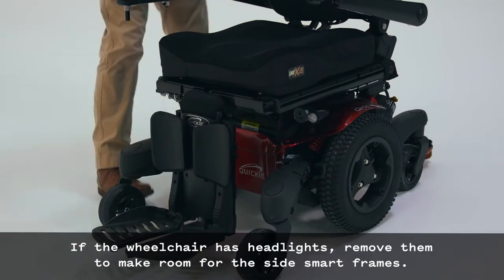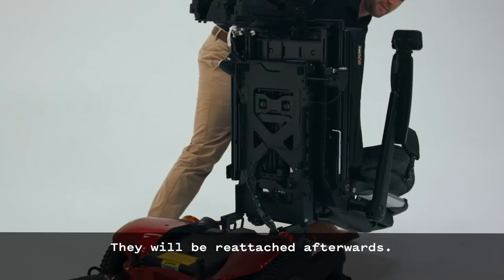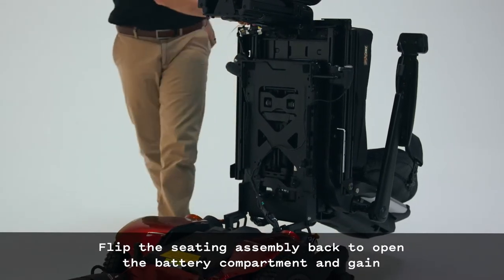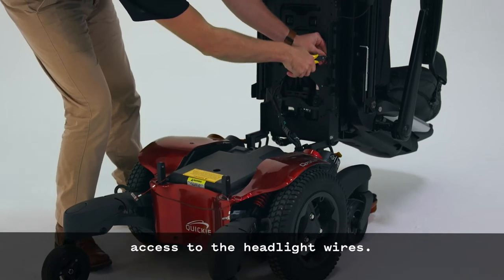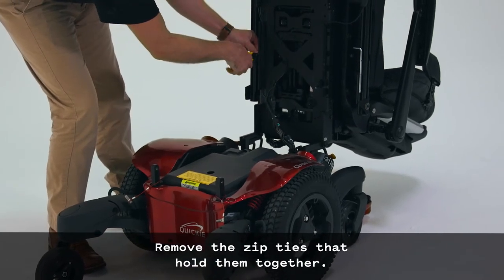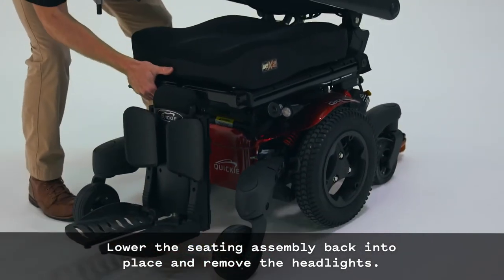If the wheelchair has headlights, remove them to make room for the side smart frames. They will be reattached afterwards. Flip the seating assembly back to open the battery compartment and gain access to the headlight wires. Remove the zip ties that hold them together. Lower the seating assembly back into place and remove the headlights.